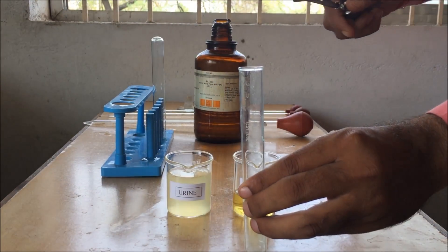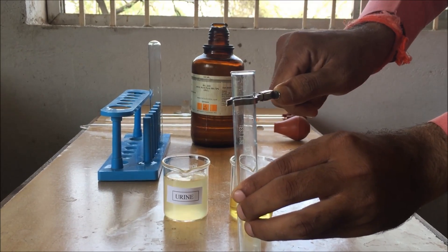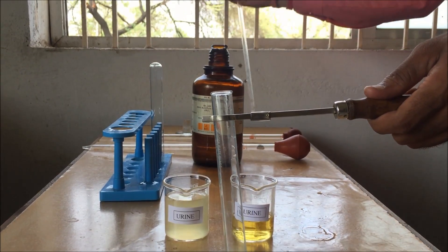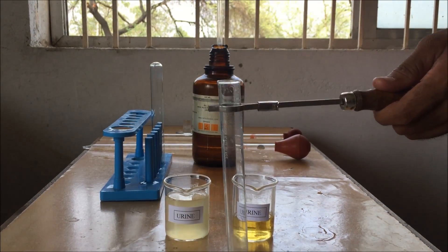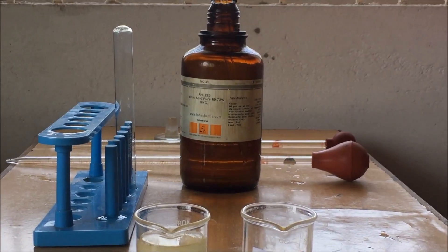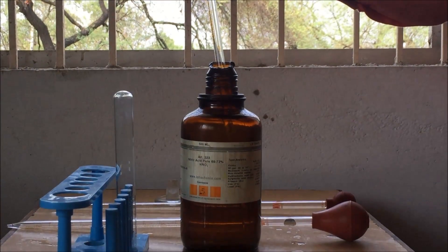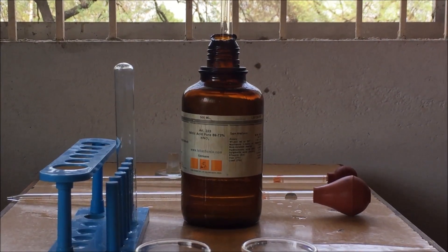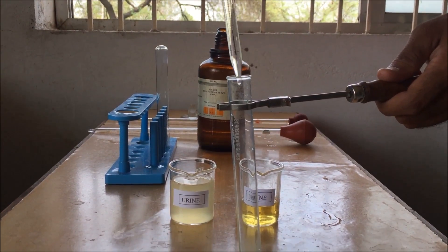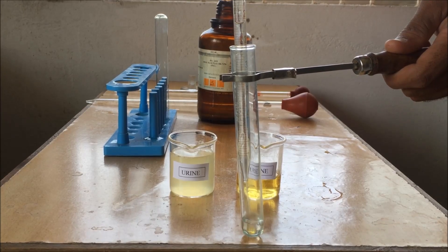Now there is another method to determine the albumin in urine, that is the nitric acid method. We will require concentrated nitric acid. Thus, safety is our prime concern. Firstly, clamp the test tube with the test tube holder and transfer a small quantity of nitric acid to the test tube. This nitric acid is very concentrated, so care should be taken while transferring the nitric acid to the test tube.